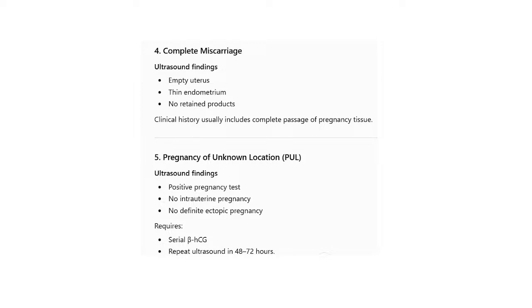If you don't see any sign of pregnancy but someone is testing positive, it warrants a transitional period where you call that a pregnancy of unknown location. It is a transitional term, after which the answer will be found. Either someone was not pregnant at all, or it was an ectopic, or it was just an early pregnancy that was to develop in the normal endometrial cavity. So you must understand those things.